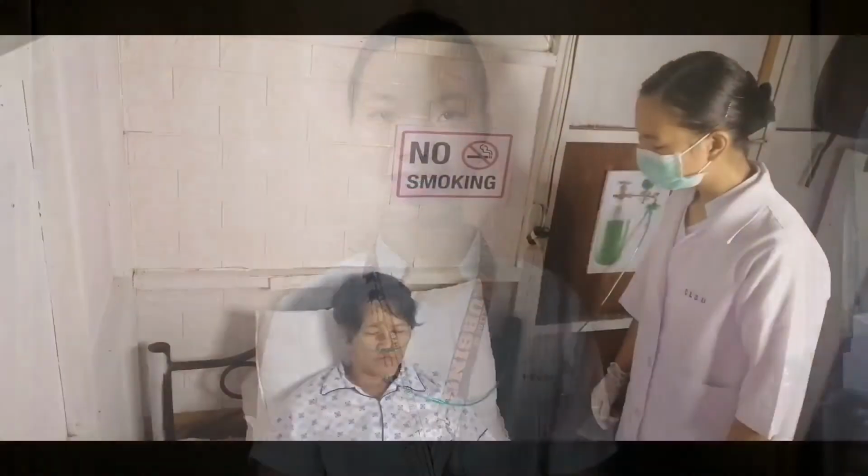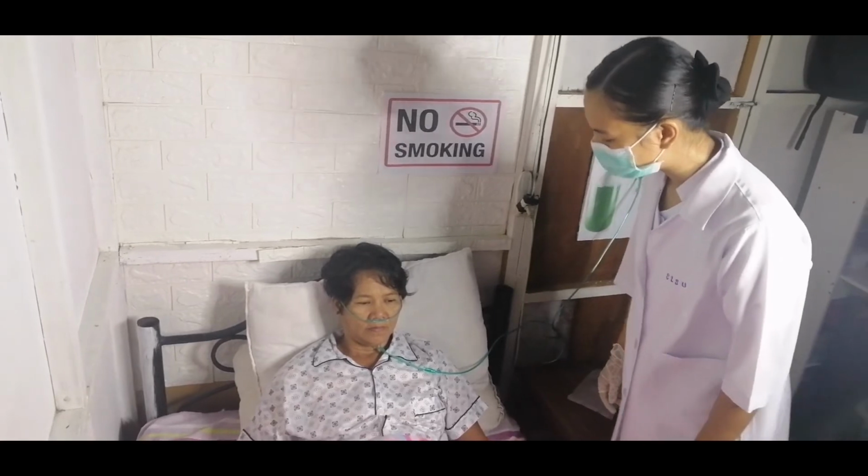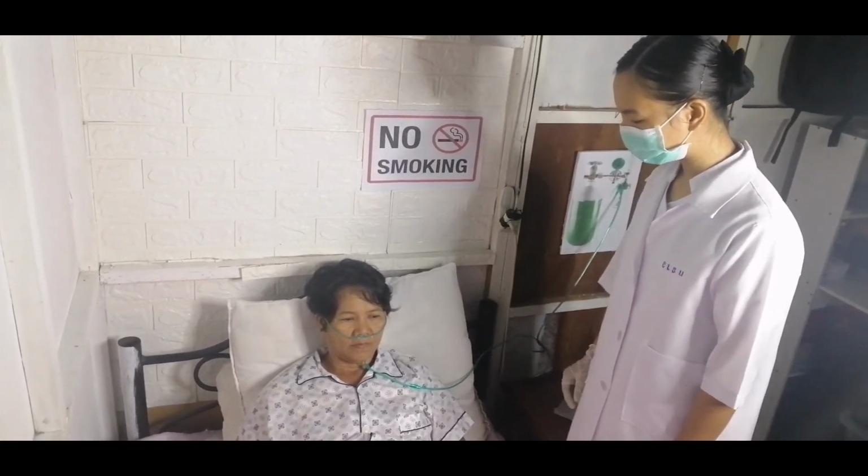Encourage patient to breathe through the nose with the mouth closed.